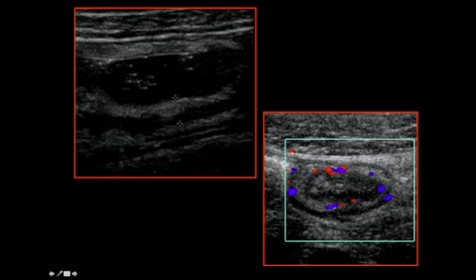Now, whenever I find abnormal bowel wall thickening, I always keep in mind whether the thickening has an intrinsic or an extrinsic pattern, and I would like to remind you once again about the cecum I showed you earlier with the typical reactive or secondary thickening to appendicitis, and contrast it to this patient with intrinsic thickening, in which we have circumferential thickening centered more on the inner than the outer layers.